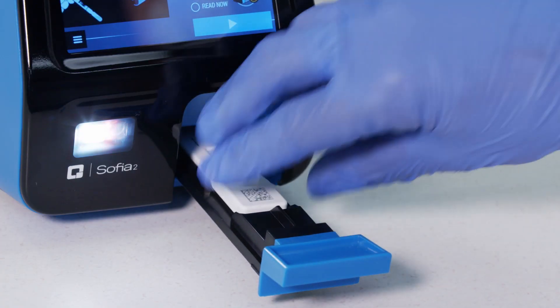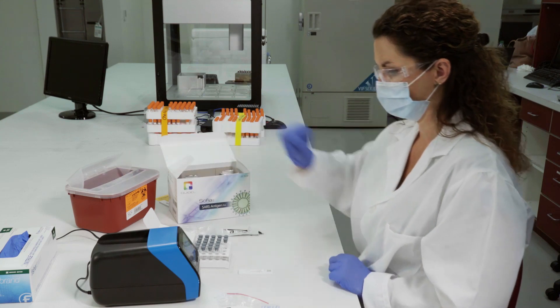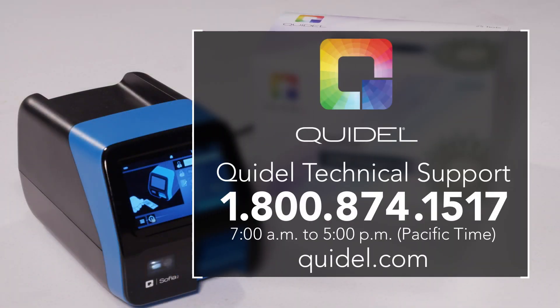Discard cassettes in an approved biohazard container or in accordance with your institution's policies. For any technical support issues regarding SOFIA2 or SOFIA assays, users can visit Quidel.com or contact Quidel Technical Support at 800-874-1517.